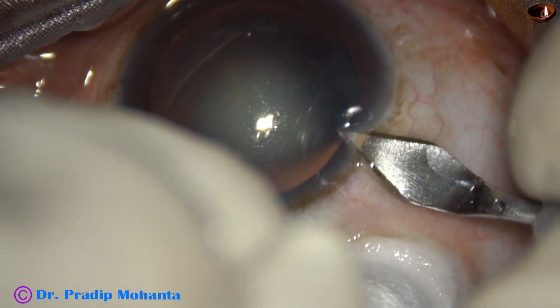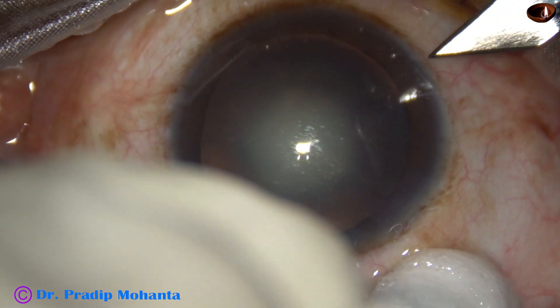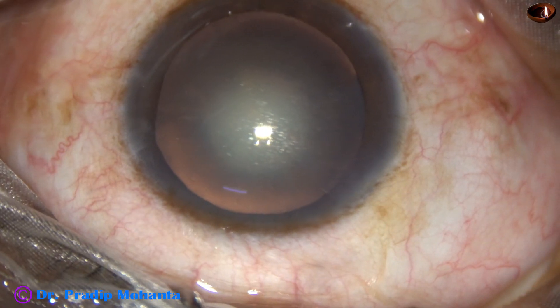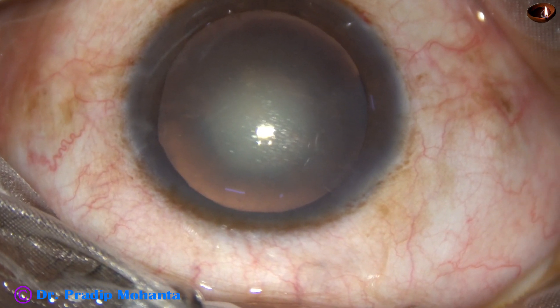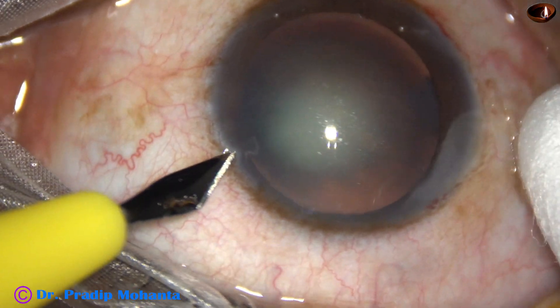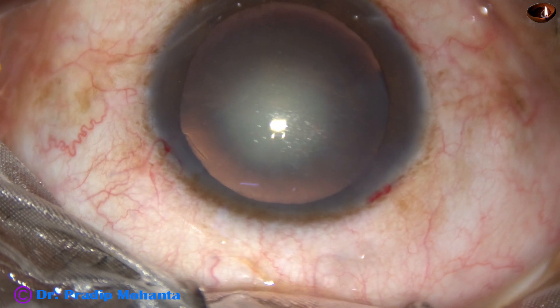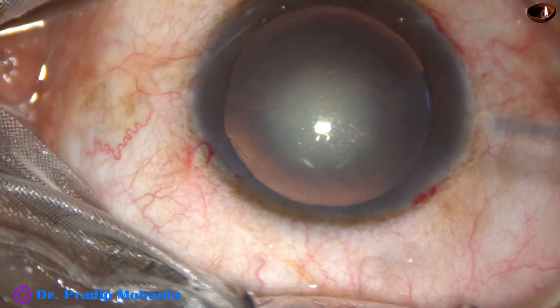This is the main incision with a 2.8 mm steel keratome at mid-limbus. This is a side port on the right side of the main incision, and this is another side port on the left side of the main incision. The side ports are about 3 clock hours away from the main incision.